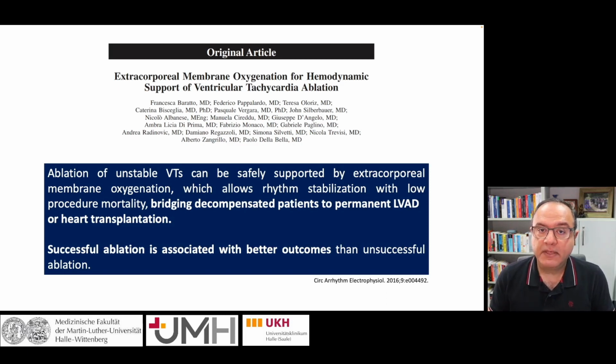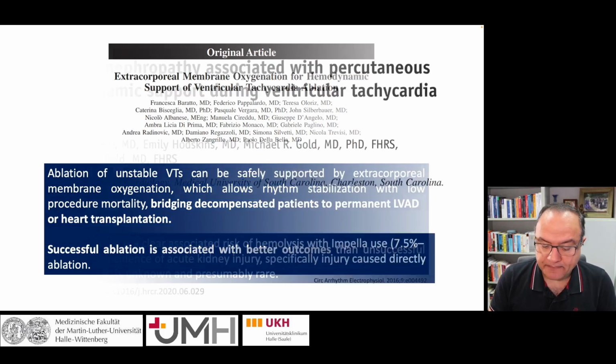So every time we use the hemodynamic support in a prophylactic way, we have to think about what the next step is if we are not able to wean the patient from hemodynamic support: going for implanting a left ventricular assist device or going for high urgency cardiac transplantation. And we have to discuss these points with the patients if hemodynamic support cannot be weaned after catheter ablation.